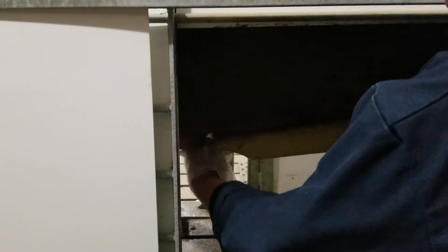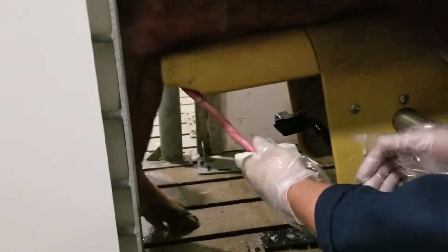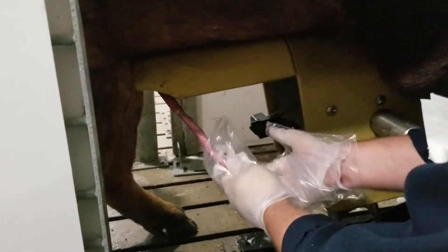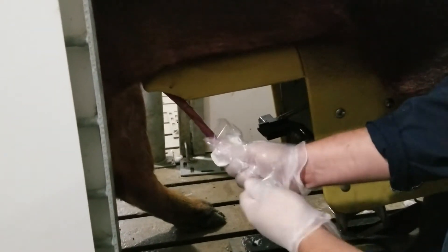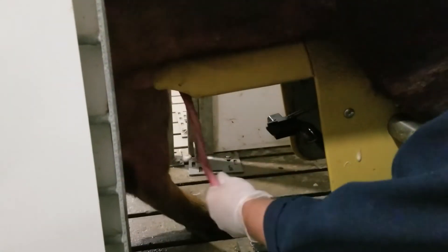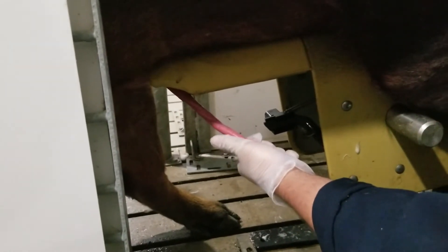I'm going to reach in and get a hold of the penis. Once I've got him extended out and he's calmed down a little bit, I'm going to take that glove and roll it over the top. I'm going to switch my hands. Now I'm going to take my other poly glove, roll that over the top and switch my hands again while I'm pulling the paper towel downward. Now I've got the penis in my hand with the clean glove.